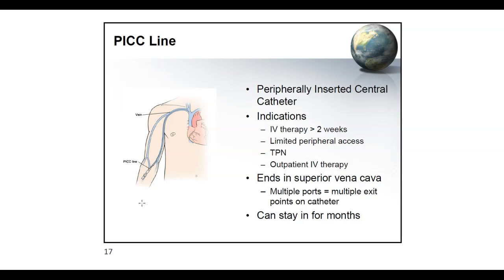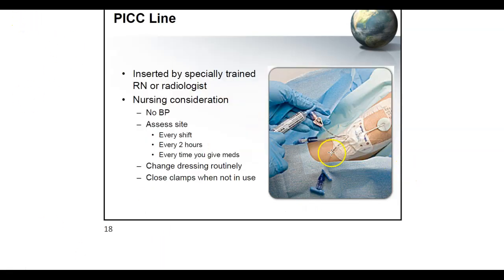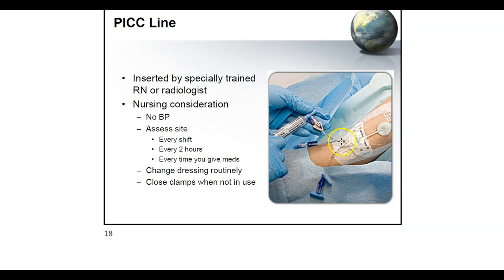So anyway, PICC lines can stay in for months. As mentioned earlier, a PICC line can be inserted by a specially trained RN, radiologist, or respiratory therapist. There is at least one hospital here in town wherein RTs actually insert PICC lines, which was very interesting.